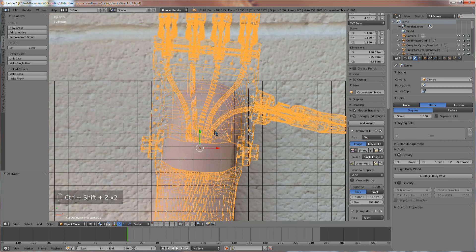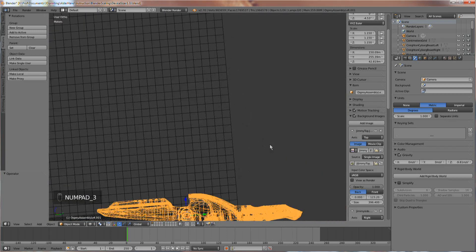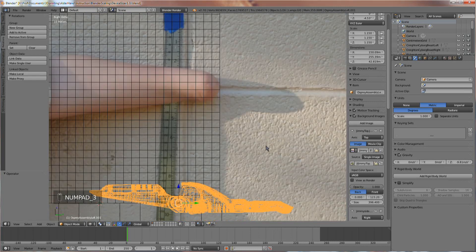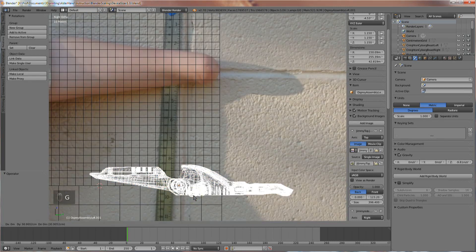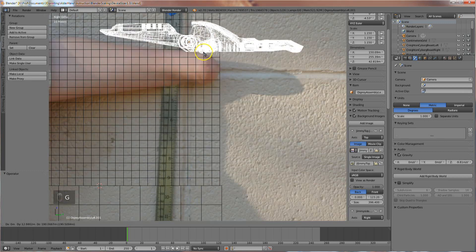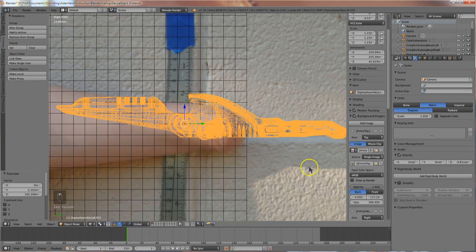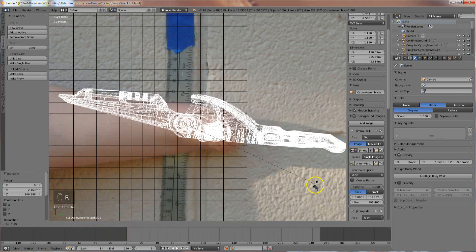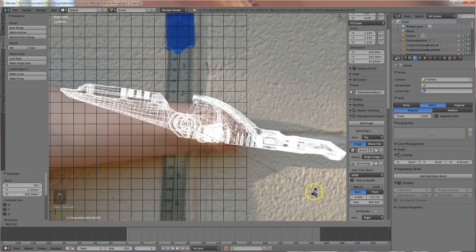Let's go into side view. I'm making a left-hand device, so I'm using right-side view. Use the G key again to grab and the R key to rotate the device until it appears to fit the client properly.